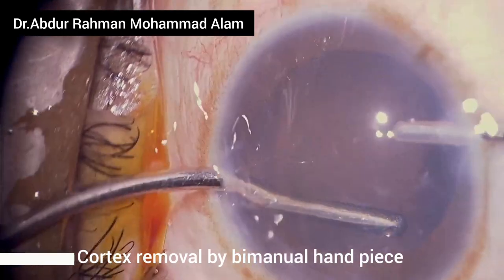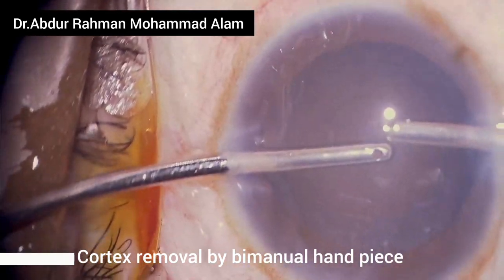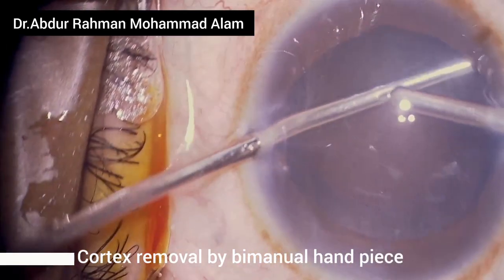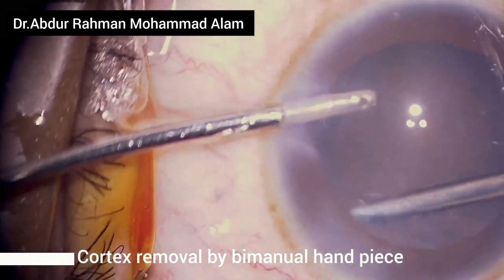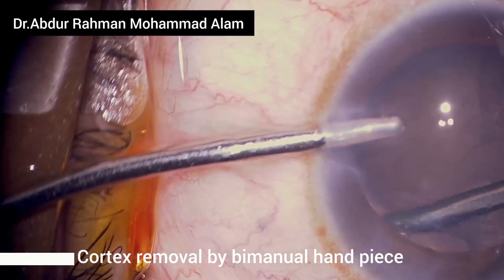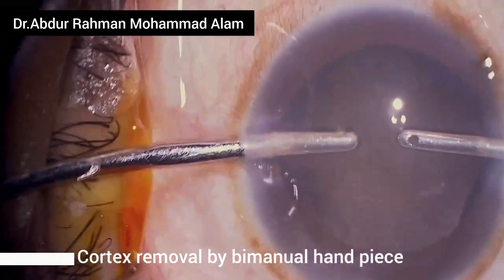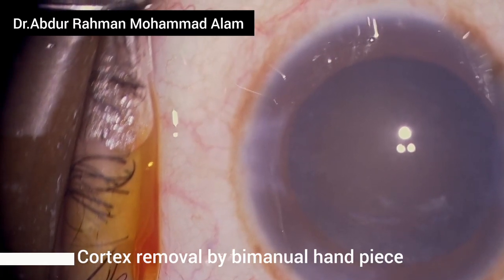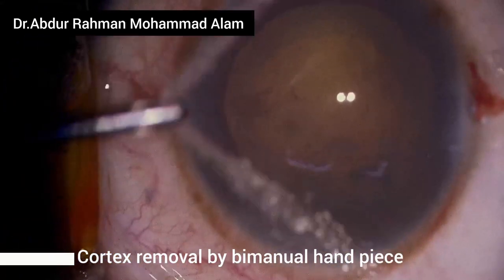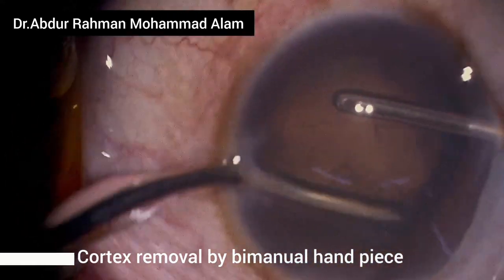I'm finding difficulty in removing the cortex because in white intumescent cataract, most of the time there is thin adherent cortex which sticks to the posterior capsule and does not want to be aspirated or loosened with rubbing. But with persistent dedication and patience, you can remove this adherent cortex. I switched to red illumination for better visualization, and now I'm finding it easier to remove the cortex from the posterior capsule.